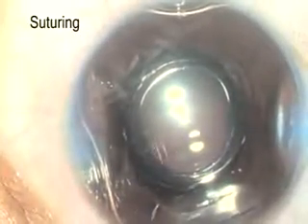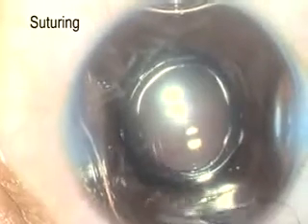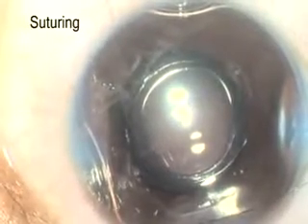In infants, all incisions are sutured to prevent leakage due to low scleral rigidity and also because children are more likely to injure themselves.